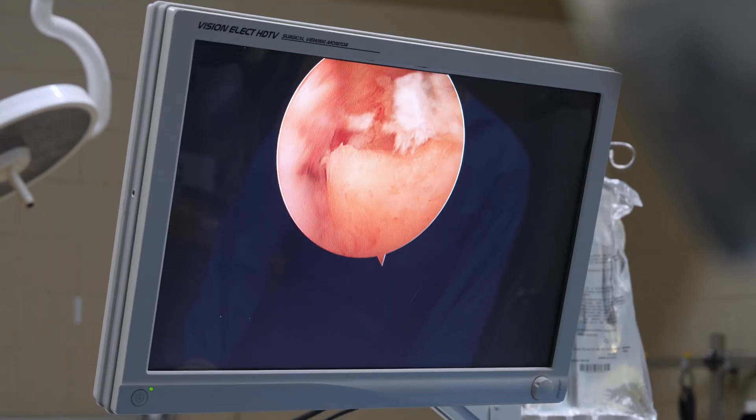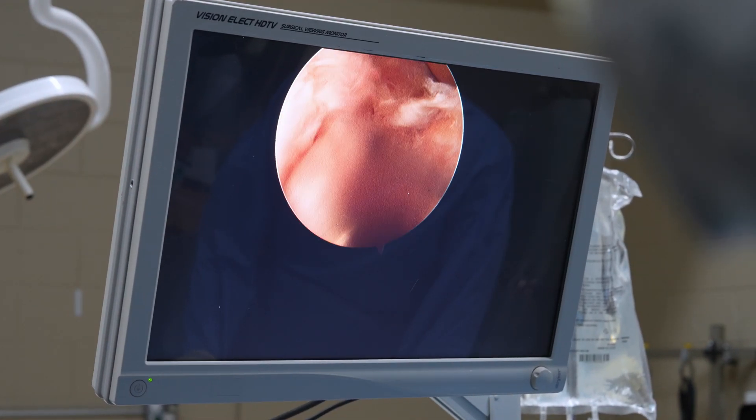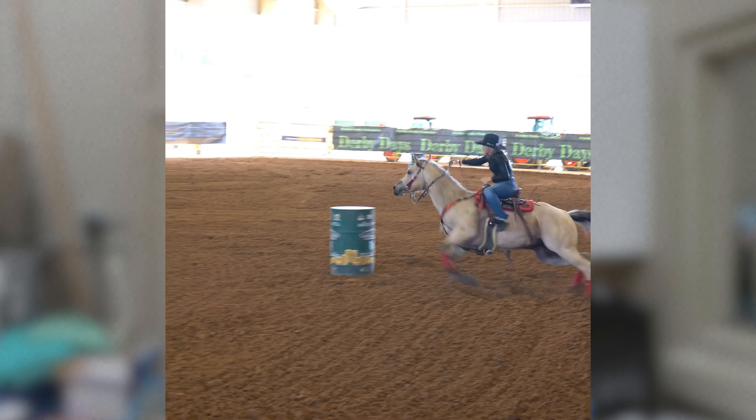If you're here, it's because you want to learn, and what I want to make sure is that I provide value and teaching at all times. Today my surgical team here at EPIC is removing chip fragments from the horse's knee. The horse's knee is the same as the human carpus — actually not exactly the same, but very similar. These injuries happen at high speed, usually when horses are racing, jumping, or doing high-level activities.